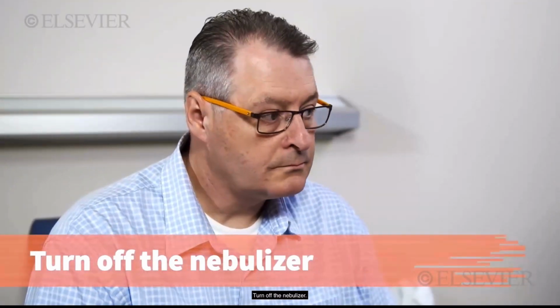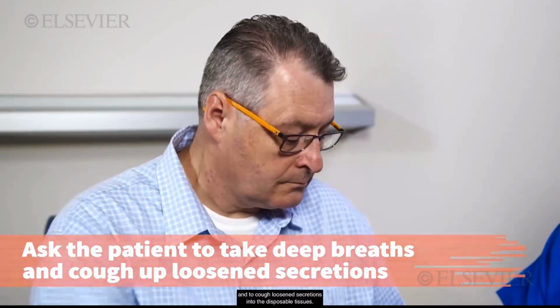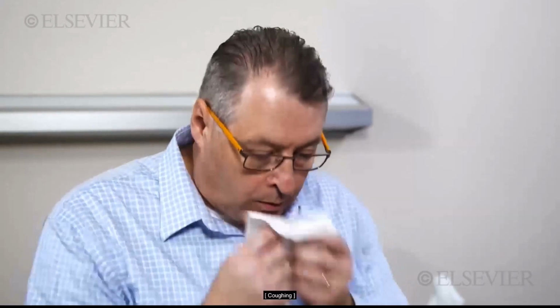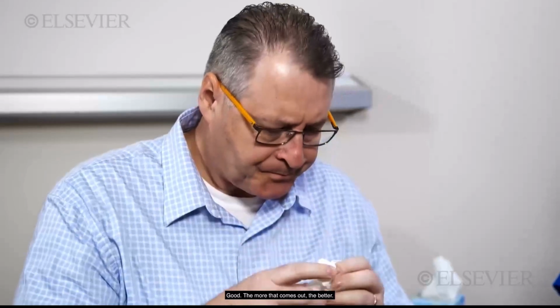Turn off the nebulizer. Ask the patient to take several deep breaths and to cough loosened secretions into disposable tissues. Take a couple Kleenexes, and you're going to cough any secretions, anything you have in your lungs after that treatment, into those Kleenexes. I'll get you the trash can in a second. Good. Keep coughing that up. The more it comes out, the better.